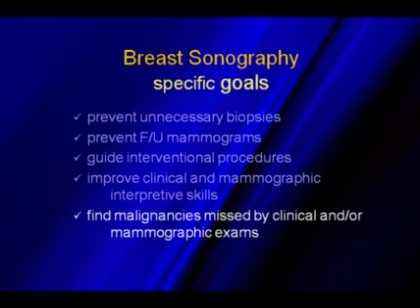And the last thing I put here is to find malignancies missed by the clinical and/or mammographic exam. I'm not saying that ultrasound is here to replace mammography. That is still our screening modality of choice. But I'm sure all of you have had a patient that had a, quote, negative mammogram that we were able to find a breast cancer with ultrasound.